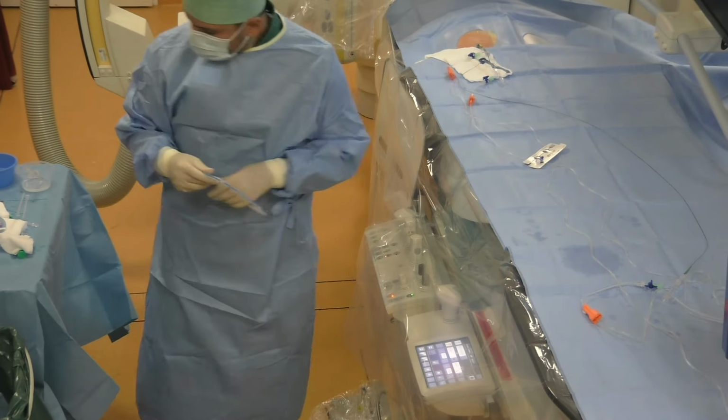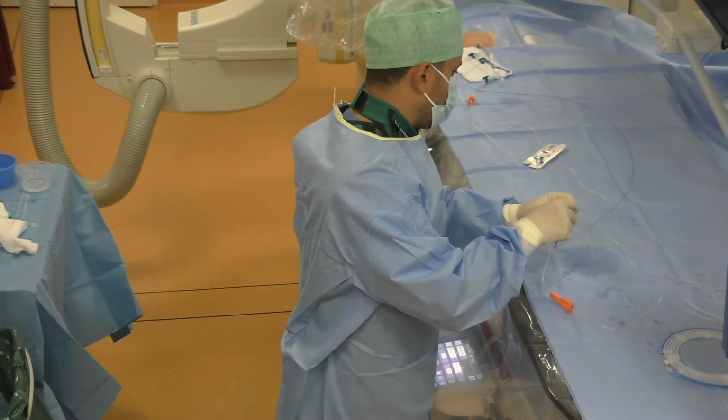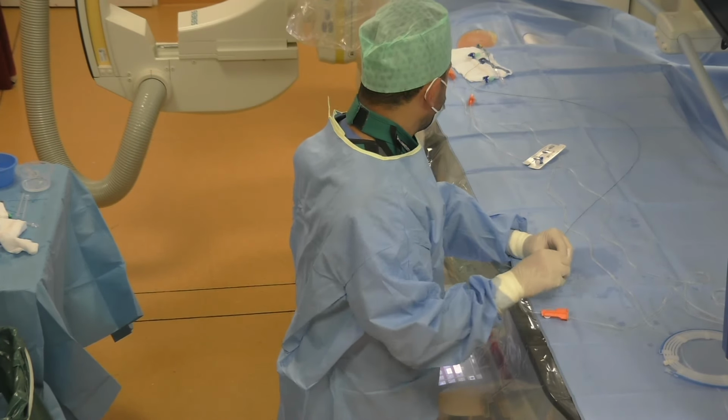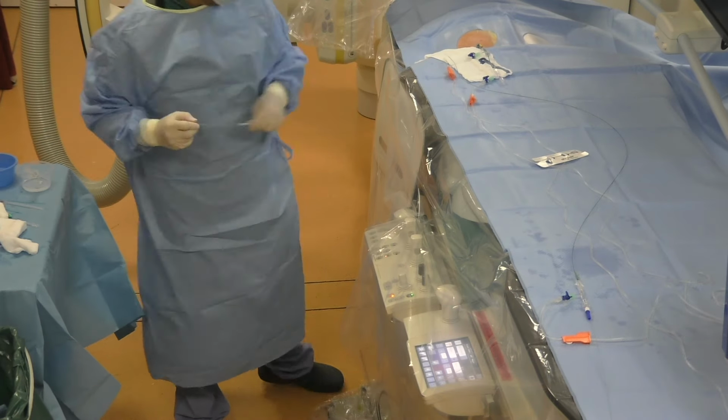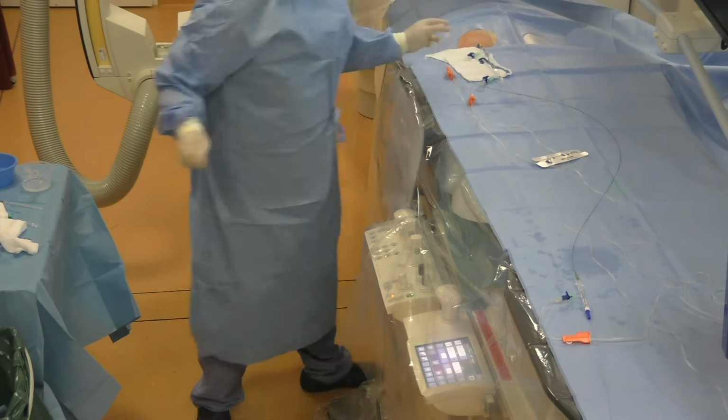And now we take our microcatheter Headway 21. It's 156 centimeters long. And now we take our microwire Synchro 14. We put the torquer behind and we can shape the tip of the microwire. And now we can adjust our working position according to the 3D angiogram.